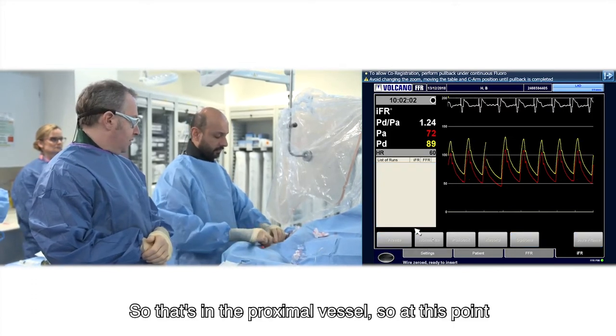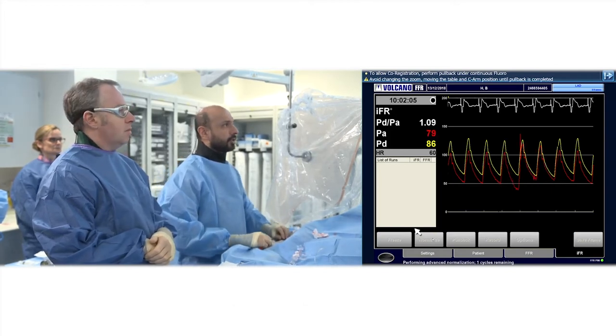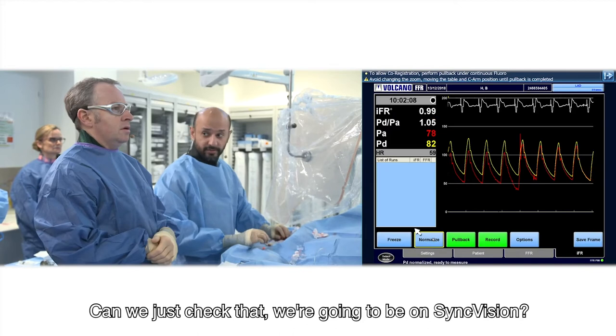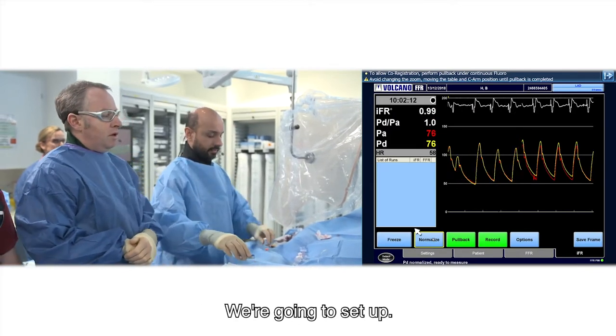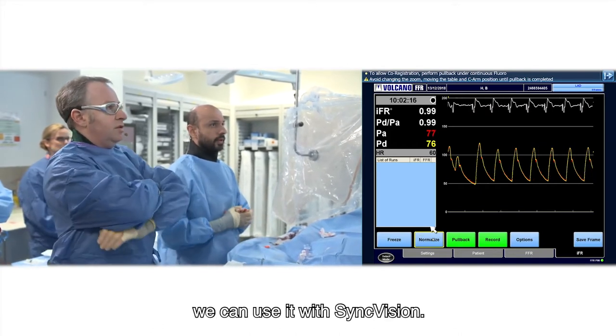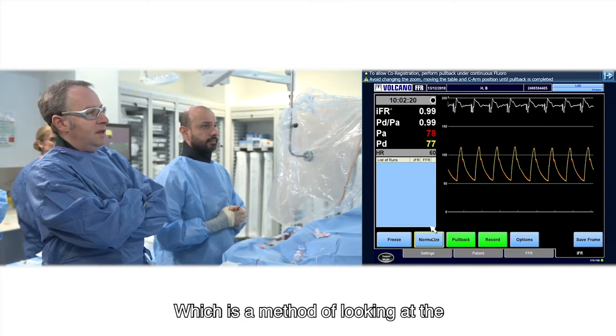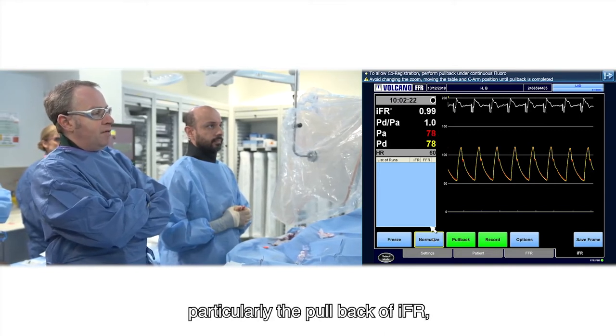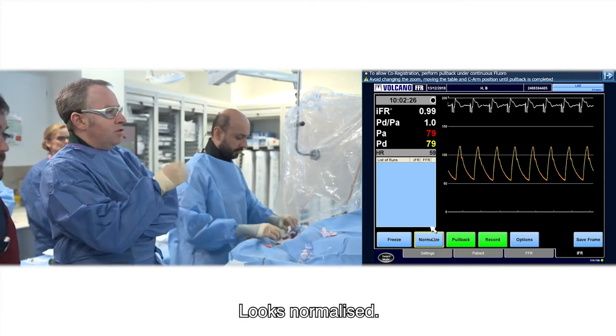So that's in the proximal vessel, so at this point we'll just gently bring the introducer needle back. Can we just check that we're going to be on sync vision? The great thing about the Verato wire is that we can use it with sync vision, which is a method of looking at the pullback of IFR to understand where the step ups are. Looks normalized.